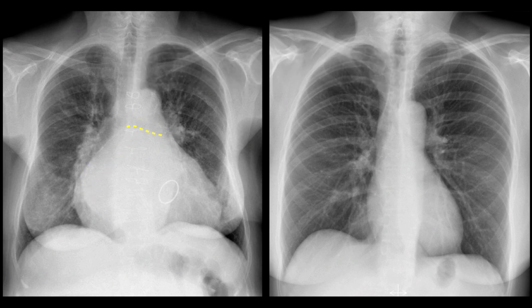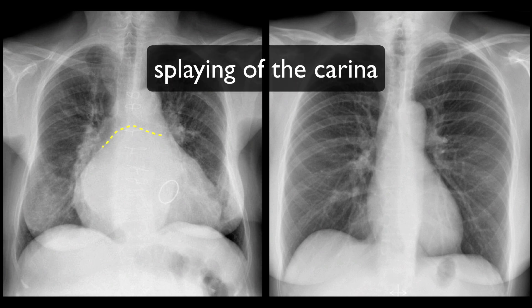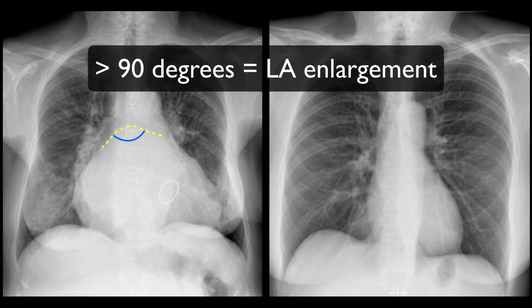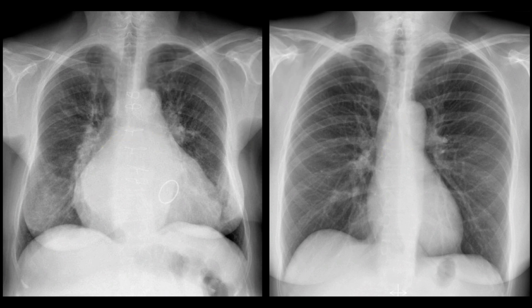The main bronchi themselves can also be used to assess left atrial enlargement. As the left atrium dilates, it causes splaying or widening of the carina. An angle of greater than 90 degrees is considered a sign of left atrial enlargement. As you can see in our normal patient, the carinal angle is nowhere near 90 degrees.